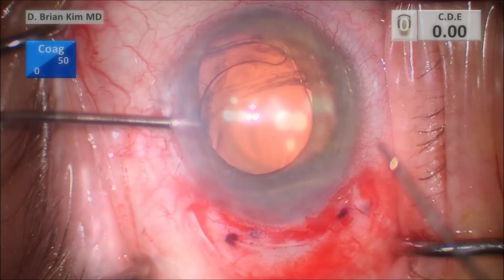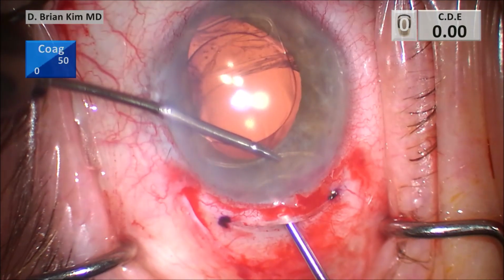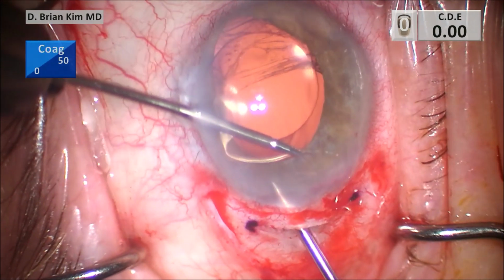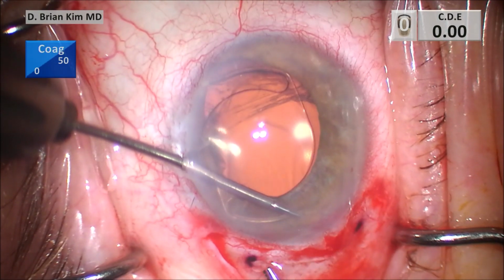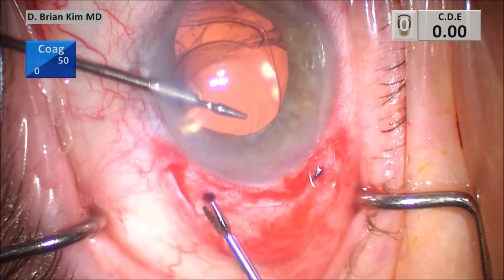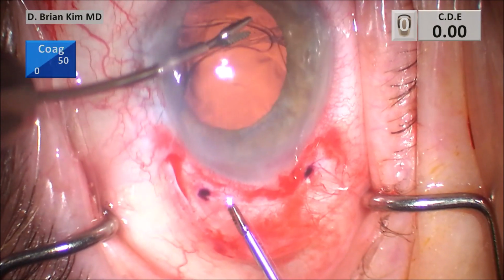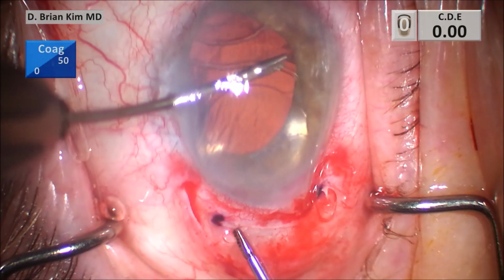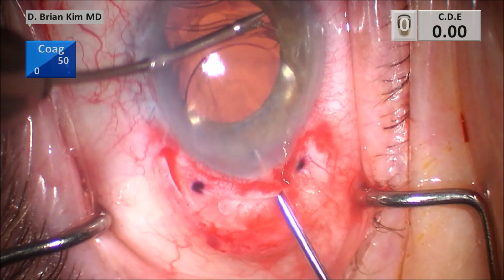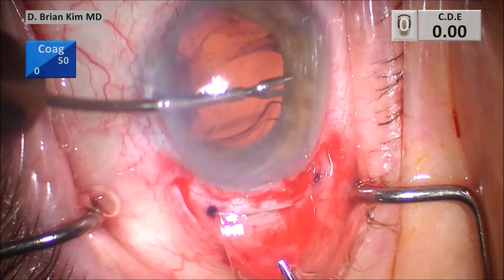And once I've made that incision, I'm going to go in and grab the proximal haptic of the ACIOL. This is a 2-handed microforceps technique here. I'm able to very gently externalize that proximal ACIOL haptic, including the tip and then the elbow. Then I'm grabbing the distal ACIOL haptic, trying to make sure that it's not incarcerated in the iris, and thankfully it's not. I'm using the forceps in the right hand to pull it out, and I use the forceps in the left hand to protect the corneal endothelium.